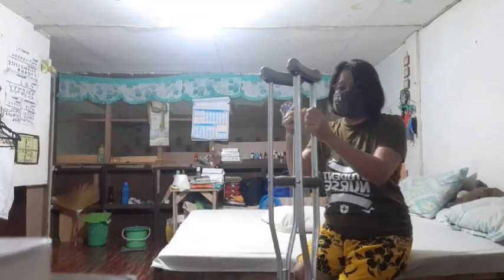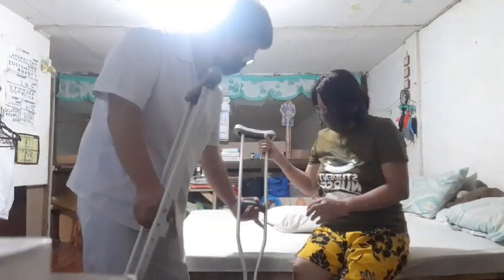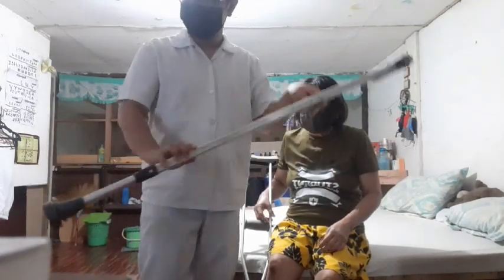Lastly, gather your equipment and materials to help save time, effort, and energy. For the procedure proper, wash your hands. Explain the procedure to the patient, emphasizing that it may take time to learn the techniques, stressing safety and the importance of moving slowly at first. When providing the explanation, include a demonstration, then assist the client to put on comfortable shoes.